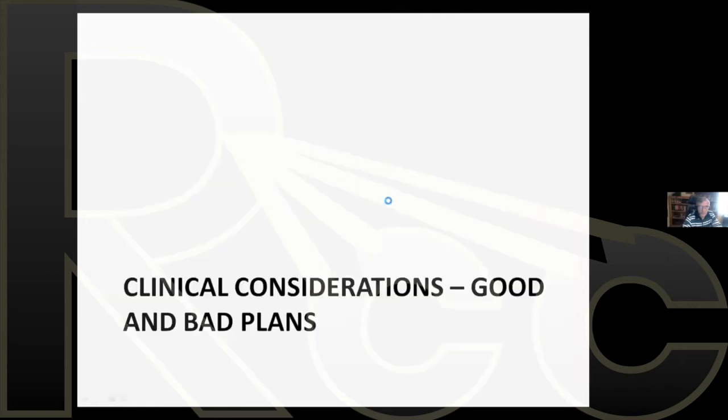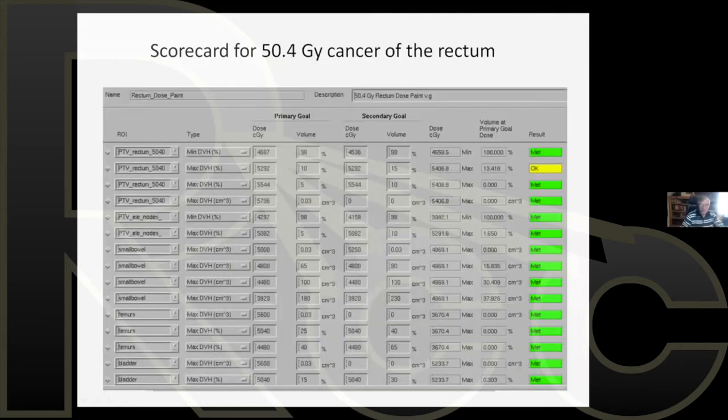So in summary, for my part of the talk, dose volume histograms are extremely critical in evaluating a plan. It gives you a common knowledge that the clinicians can all talk about, and plans actually have a way of being scored. The planners and the physicians can look at the quality of the plan in terms of dose to the target, dose to the tumor, dose to the healthy tissue around it, and come up with a measurement system, develop a table of objectives and constraints, and score them by dose volume histogram.